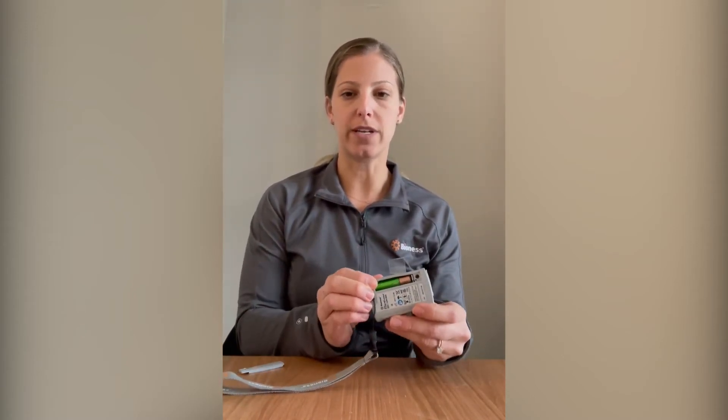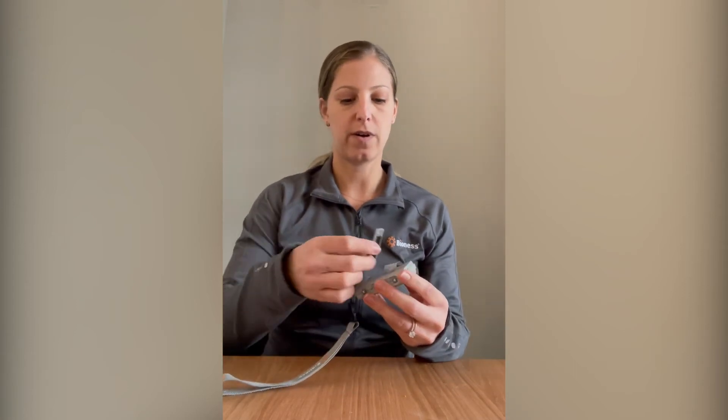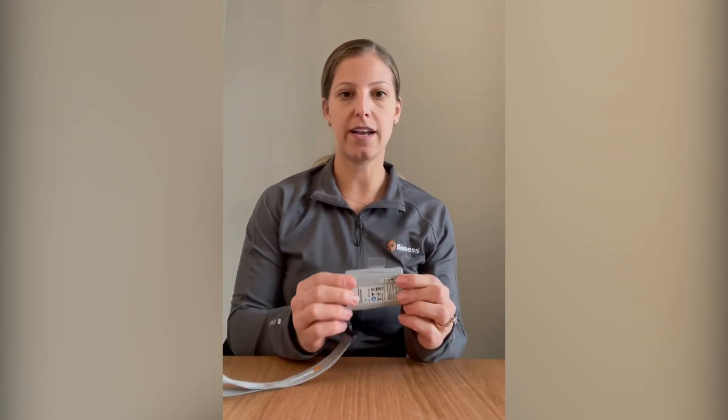Next, you will take your AAA rechargeable battery, pop out the old one and replace it with the new one. Go ahead and place the cover back on and screw it in, and there you go.